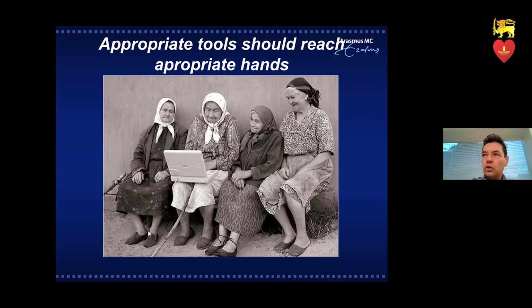She's only 48 years old. Yeah, I don't even consider bypass surgery for the left main by itself as an important issue. You do bypass surgery because you have to put in a 60 millimeter stent in one vessel, a 60 millimeter stent in another vessel, and still you see remaining disease. Probably there a new vessel is much better for us. The left main, with either provisional or even two stents, usually will give a very good, durable result.